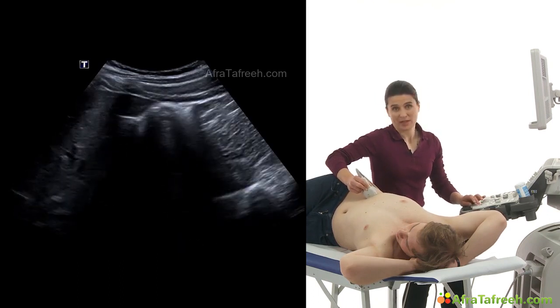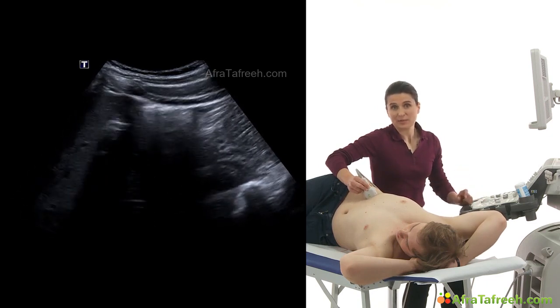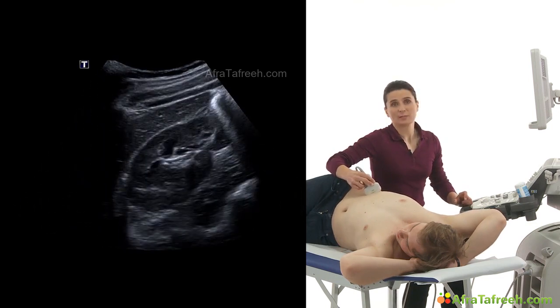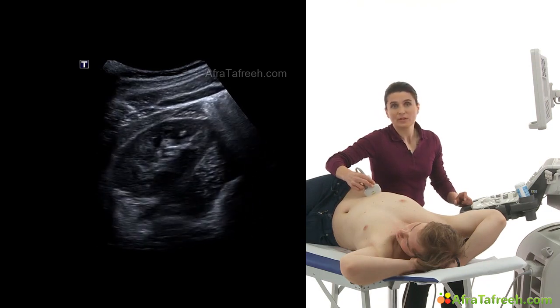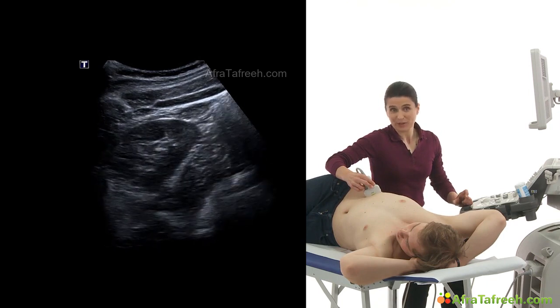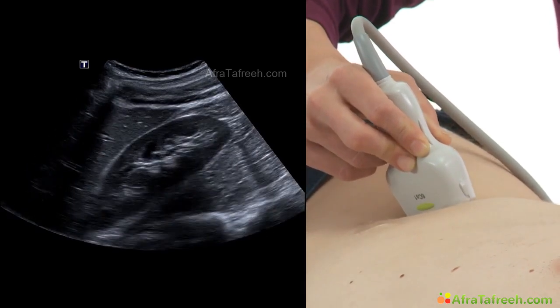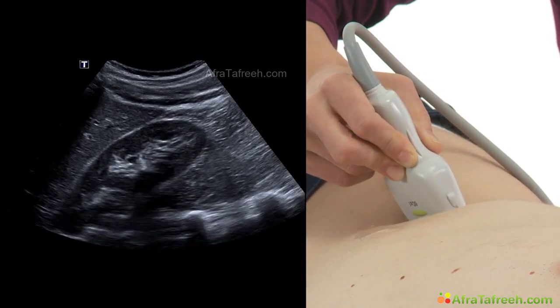When you start to scan the kidney, sometimes you just get a little part of it, just a glimpse of it. I'll show you. Please inhale again. So maybe you've got some kind of a lopsided view of your kidney. And then it's important to keep the kidney in the center of your view and turn the transducer slowly, slowly, slowly. Again, inhale and hold your breath. Thank you. Until you get the longest diameter of the kidney.